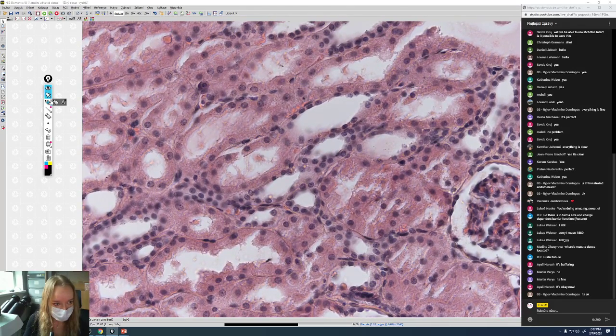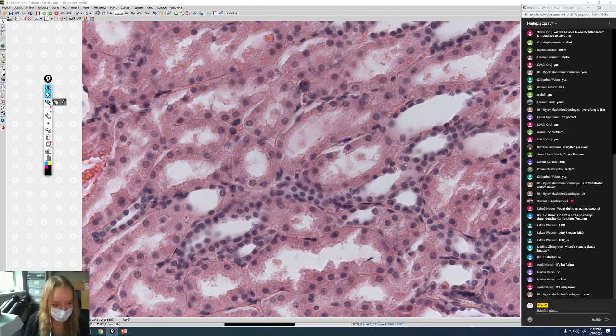We're talking about that right now: between these tubules, they're not just the nephrons in the kidney and the capsule and stuff, but between nephrons and between renal bodies, there is also a tissue. We were describing the proximal tubules and distal tubules, but that's okay.